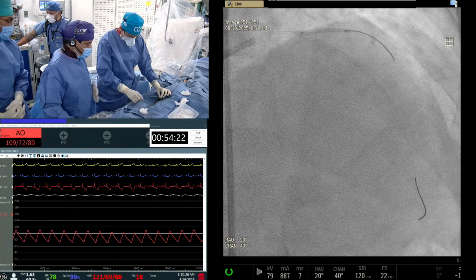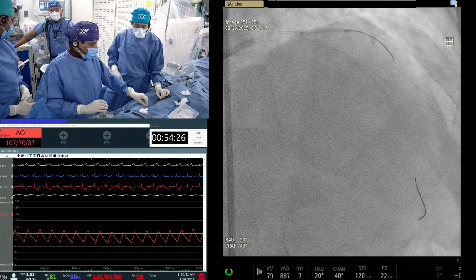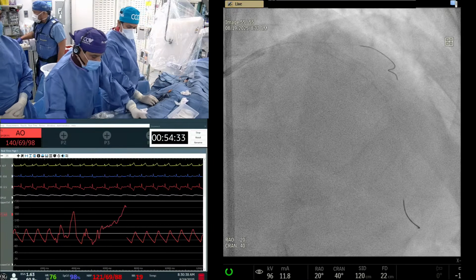2.5 by 30. There's no longer than that? And then we think put that. We may cover them. Yeah, no, but that's okay. We need 2 stents here anyway. Okay, let's take a picture after nitro. 1 second. Good.